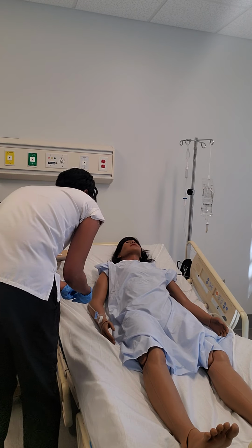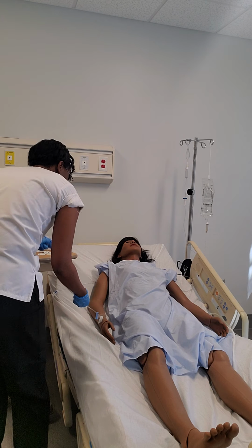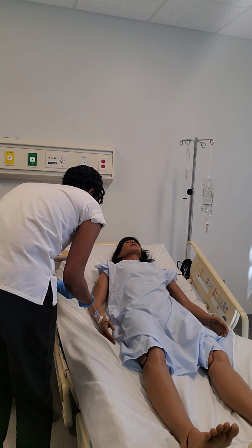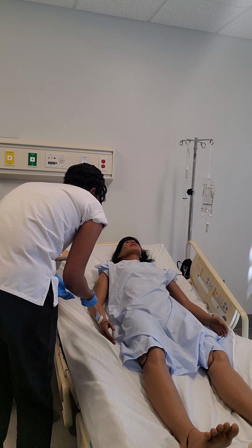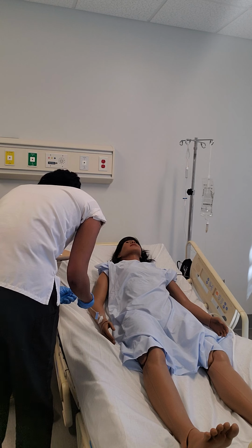I get a new white alcohol pad. I scrub the hub again. And so then I go to administer the medication, which is going to be that 4 milliliters of labetalol. This medication is supposed to be pushed over 2 minutes. So I would push over 2 minutes. I wouldn't push too rapidly. I wouldn't push too slowly.